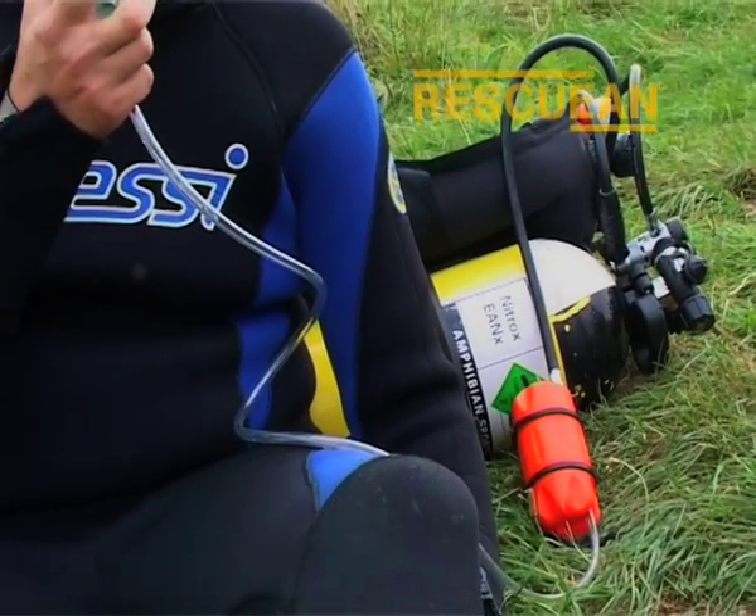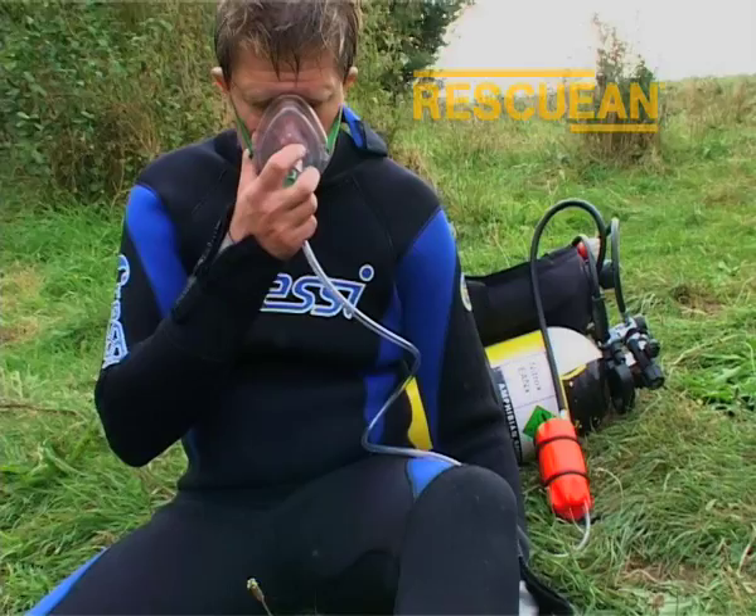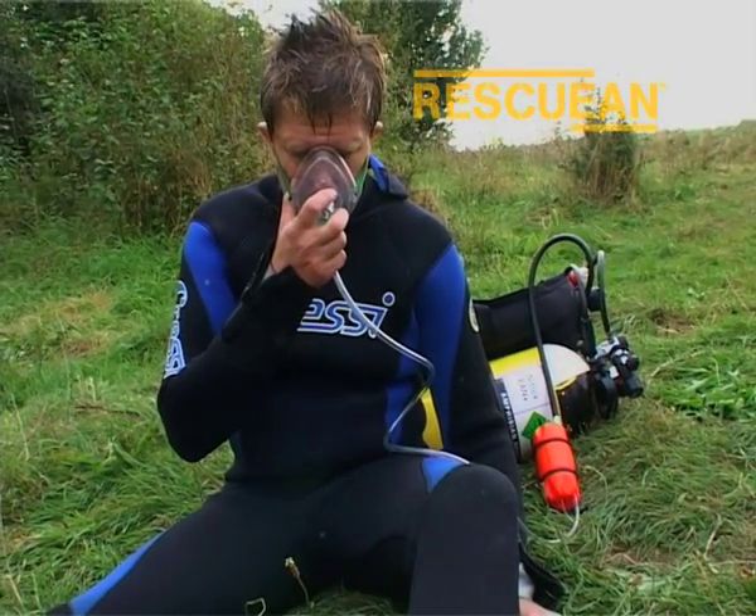A conscious diver needing O2 can also benefit from using a Rescue EAN pod, either via a pocket mask or a non-rebreather mask.